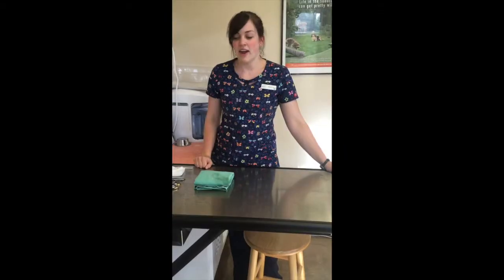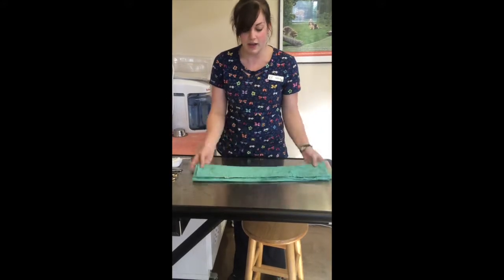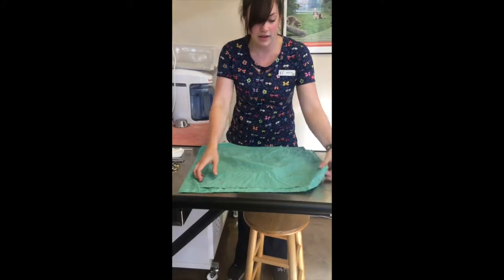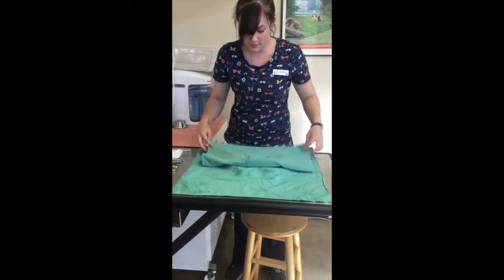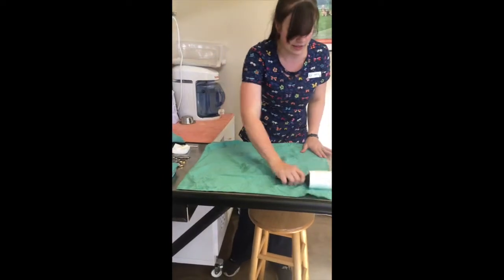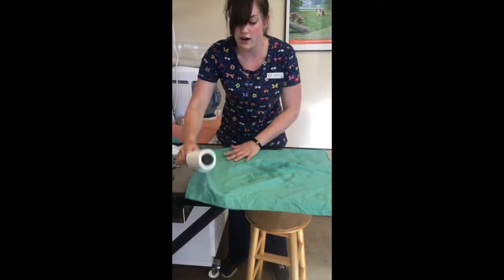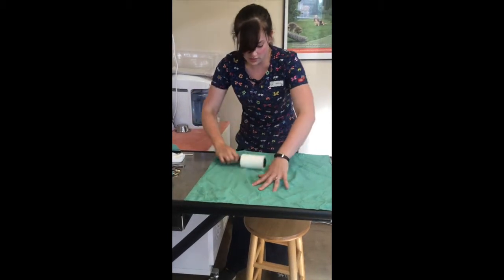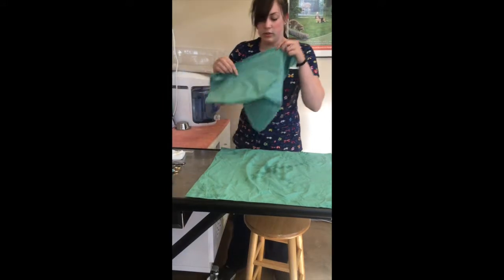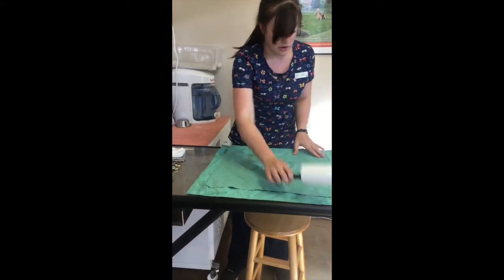and once they dry, they'll be ready to wrap into surgical packs. Alright, I'm going to be demonstrating how to properly wrap a surgical instruments pack. So this is my wrap. It's a double wrap, so I'm going to go ahead and unfold it. I'm going to take this one out real quick, and I'm going to just lightly lint roll the inside of this. Make sure there's no hair on this one. Okay. This one, do the same thing.